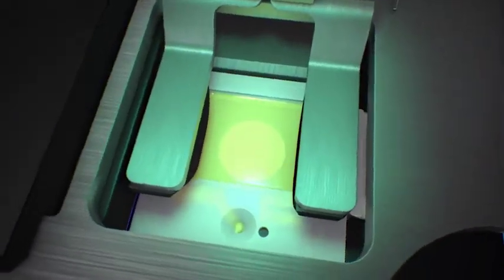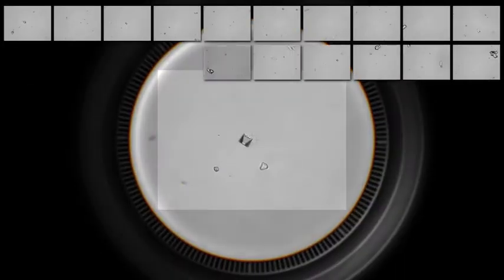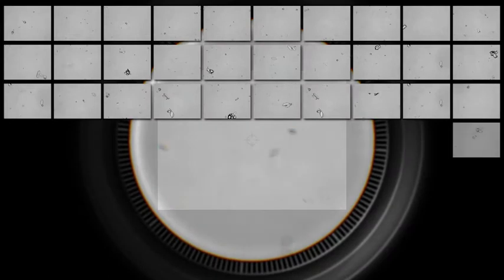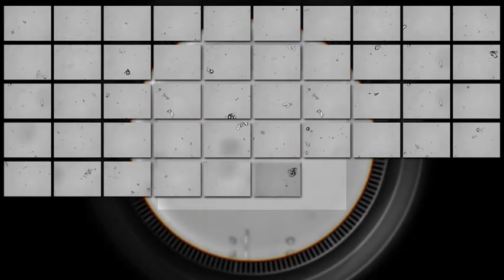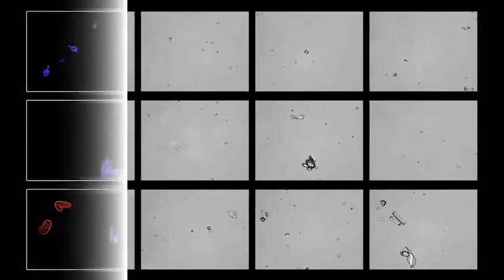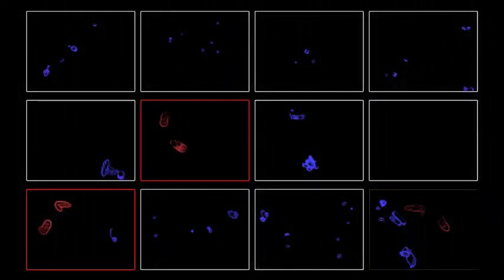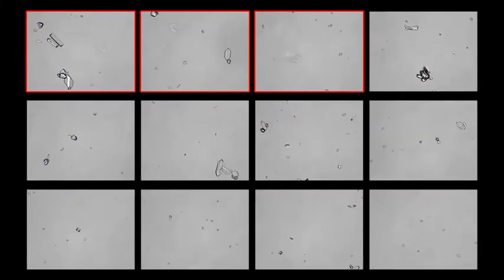The system captures 70 images which is equivalent to over 45 high power fields of view. Each image is autofocused with contrast adjustment. As seen here, the convolutional neural network technology identifies formed elements and then prioritizes the most relevant images for your review.